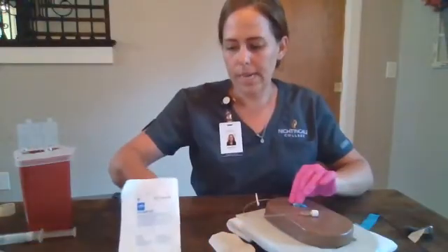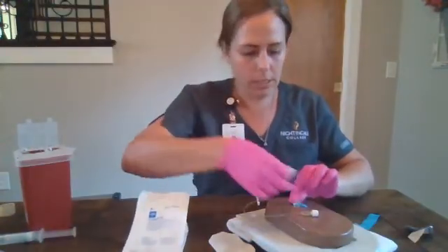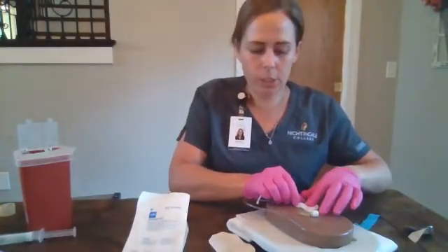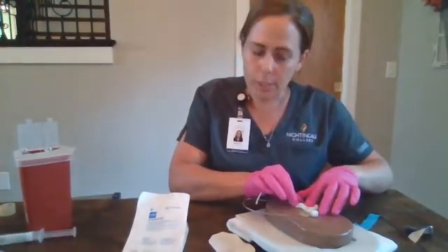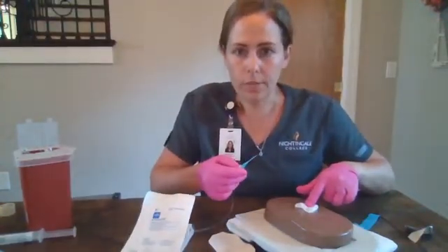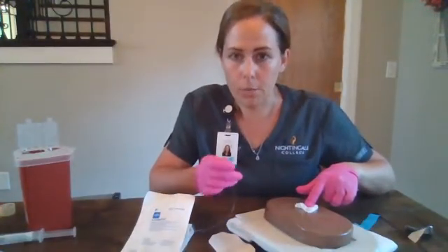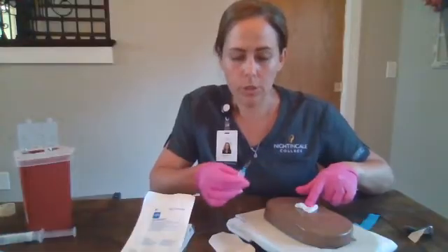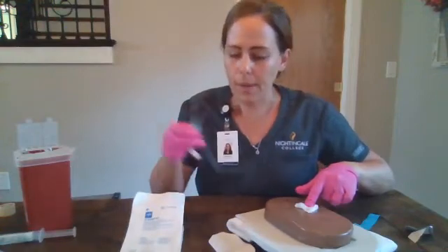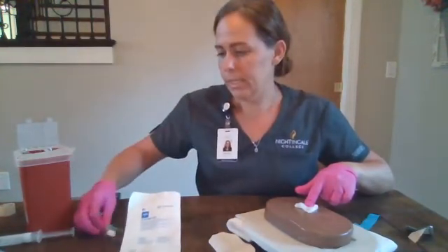We will take our sterile gauze and fold it. With a little bit of pressure, we will withdraw slow and steady our catheter. We're going to hold pressure for at least 30 seconds, if not more, until bleeding is controlled. We're going to inspect our catheter for integrity and length, and we will discard this in our sharps container.